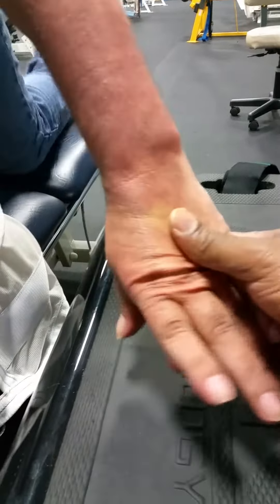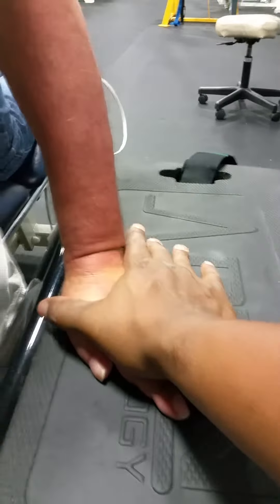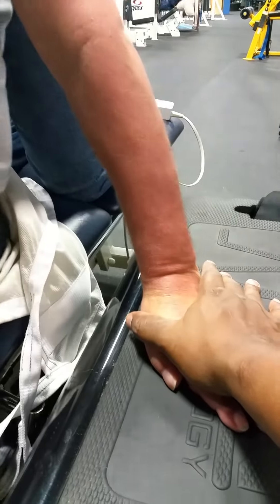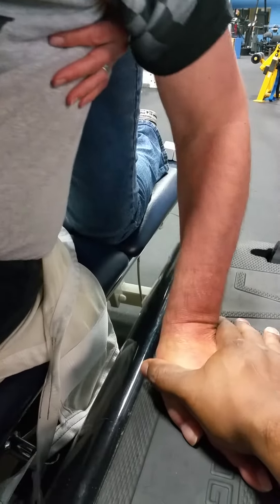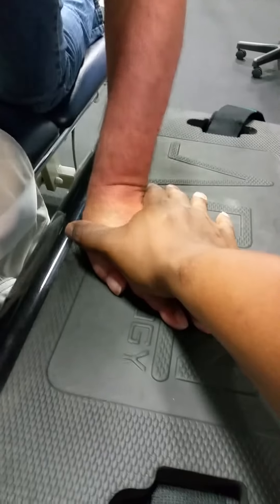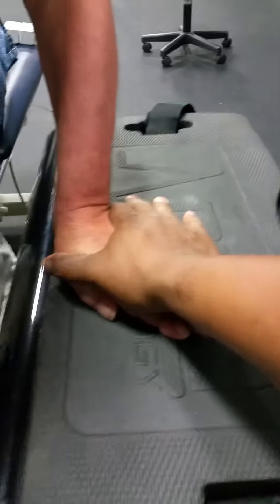Oh, it comes on there. Push off of it — yep, push. Start fisting a little bit.